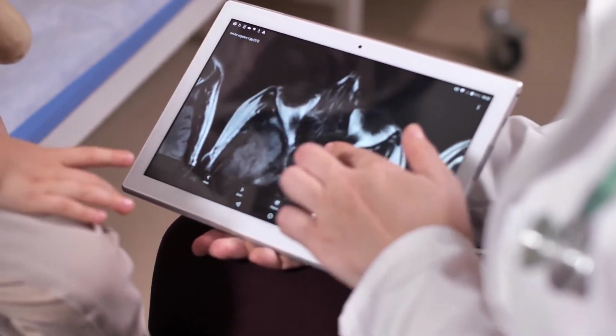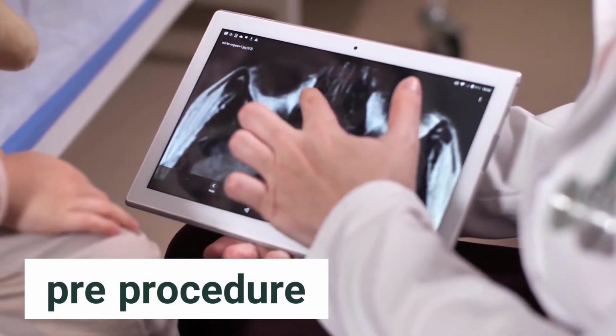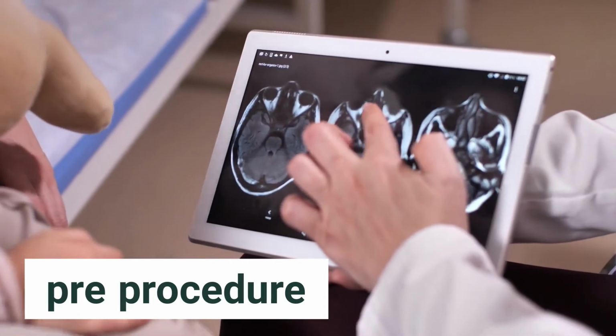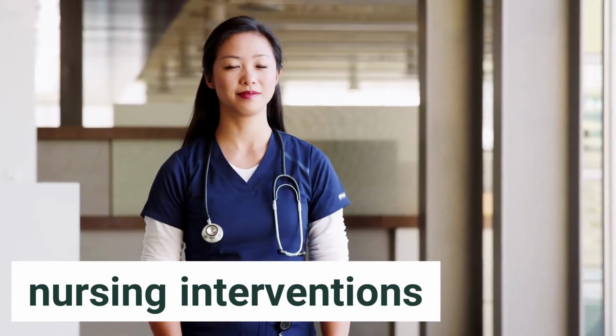Important key points to know. Pre-procedure. If the client is pregnant, a determination of the risks to the fetus versus the benefits of the information obtained by this procedure should be made. Nursing interventions. Instruct the client to refrain from consuming food or fluids for 4 to 6 hours prior to the procedure.